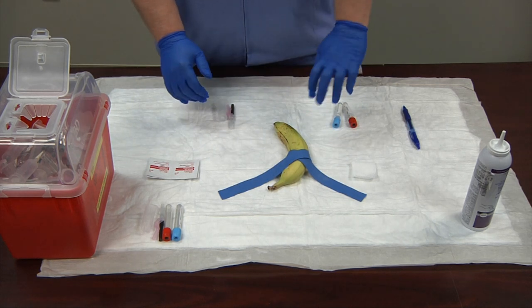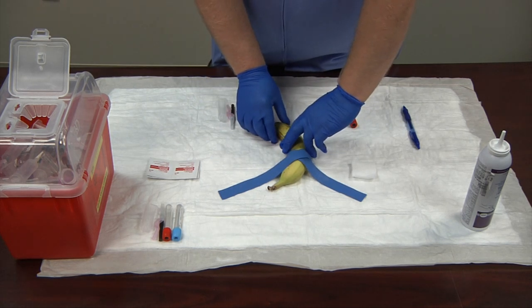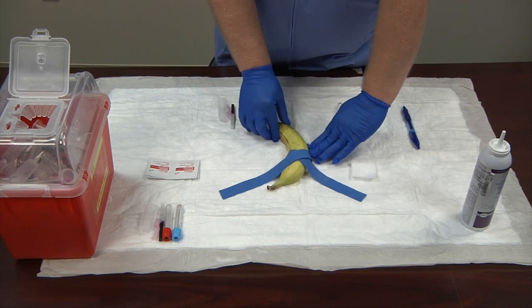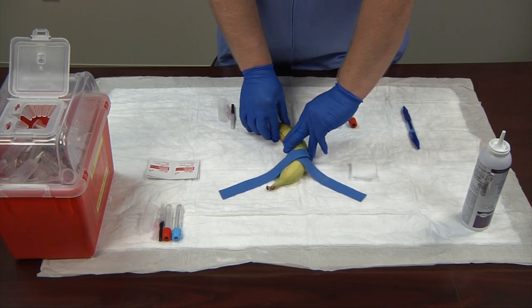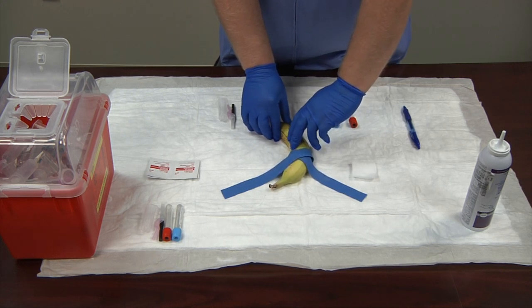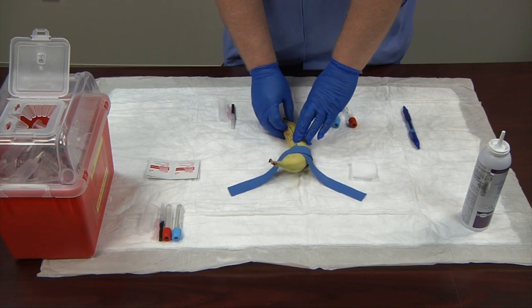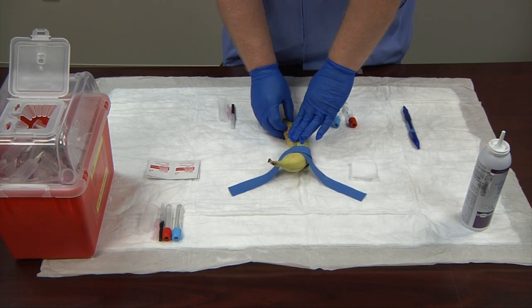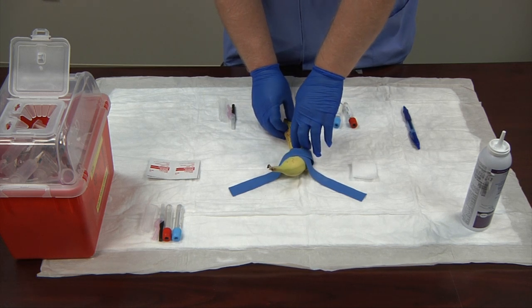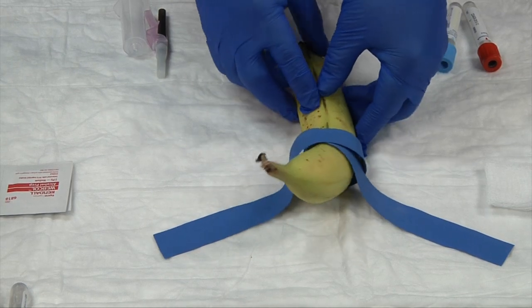With my tourniquet on, I begin to palpate. As we palpate, we use our two non-dominant index fingers, going over one side, feeling over, coming back across, and picking the vein we'd like to use. Then I'm going to do a landmark — you can use features of the skin like freckles or small pimples, or press gently with your thumbnail to make a little mark to save your spot.